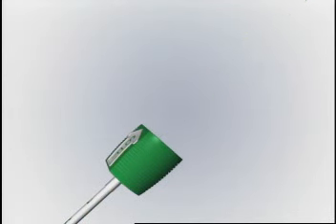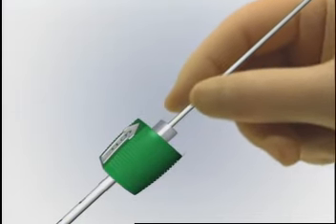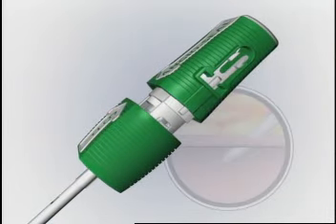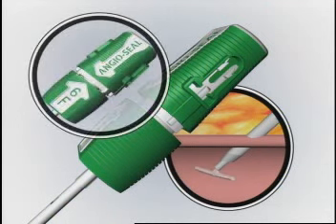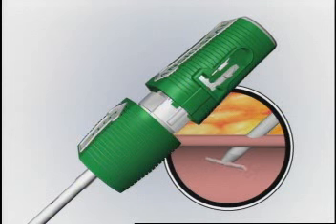Insert the Angio Seal device into the sheath hub, holding it by the carrier tube and slowly advancing it into the sheath. Bring the sheath and device hub together until you hear a click. This indicates that the anchor has exited the sheath. The arrows will be aligned and facing each other. Pull back gently on the device cap until you feel resistance. The anchor is now positioned at the proper angle against the sheath tip.